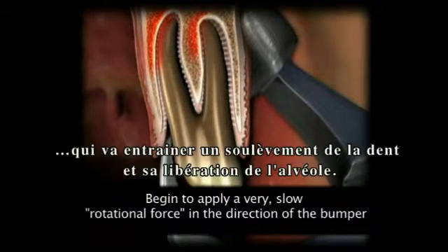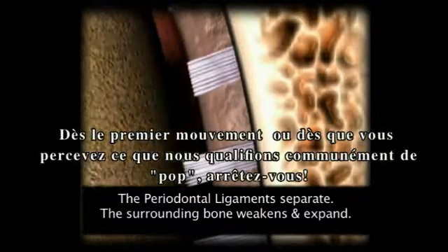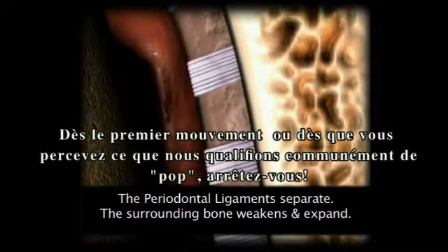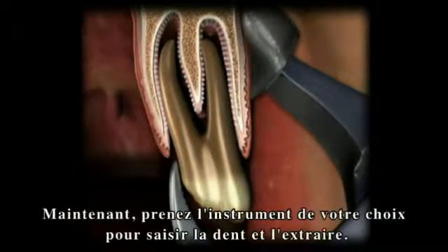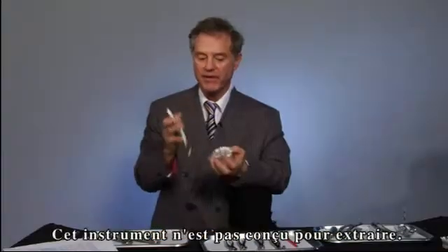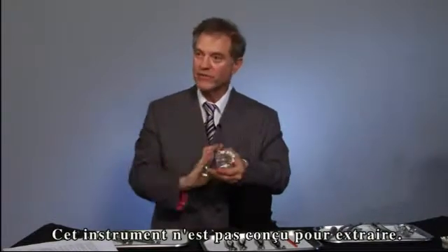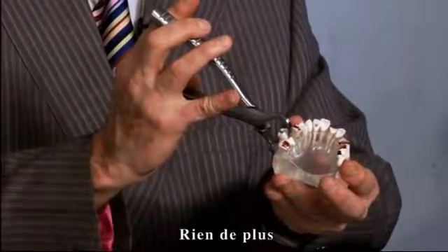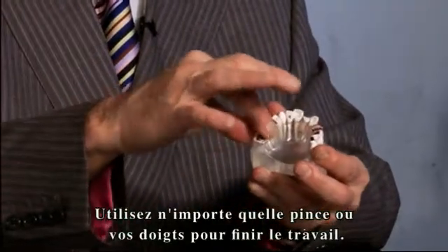Using wrist movement only, disengaging it from the socket. At the first sign of movement, or what is commonly referred to as the pop, stop — the instrument has performed its intended use. Now you can use an instrument of choice to grasp and remove the tooth from the socket. In all extractions, the instrument is not designed to take the tooth out completely. It's designed to move the tooth buccally, then stop. Use a rangeur, use a hemostat, or use your fingers to take the tooth out the rest of the way.